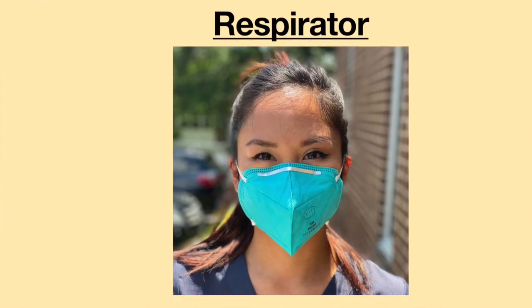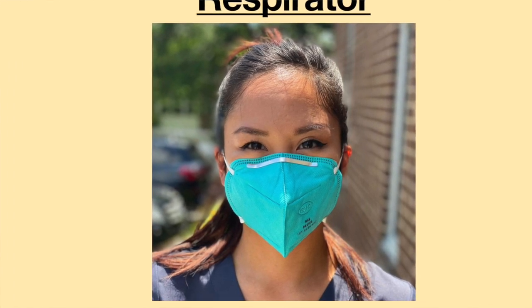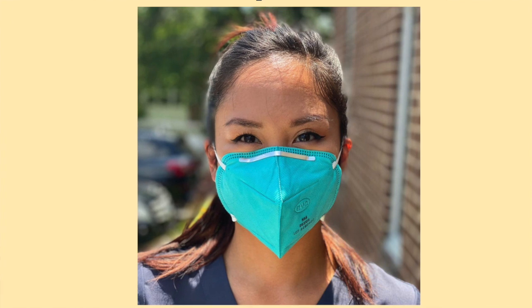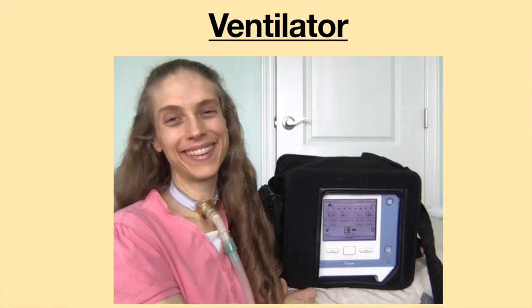When it comes to ventilators and respirators, there is a big difference in the purpose and function of each device. Respirators are masks worn to protect the wearer from noxious substances, pollution, or other particulates in the air, including airborne infectious agents.